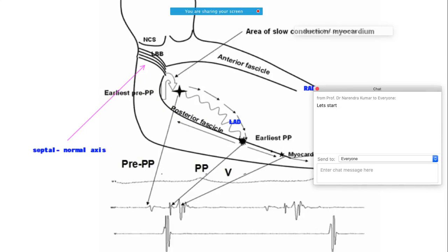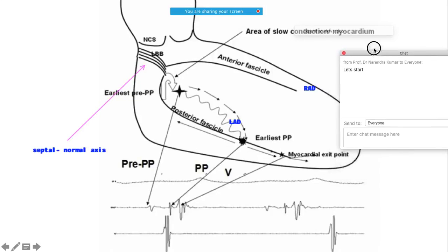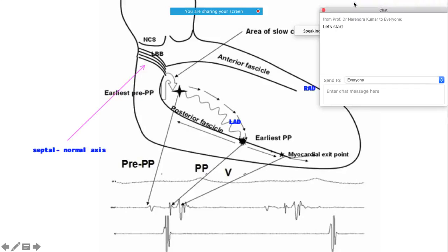If you come across an ECG, first thing we might think, okay, this is a fascicular VT. What are the other things which we may be able to see? So VT, you know the characteristic things. Most commonly, it is wider. But as I said, fascicular VTs tend to be a little bit narrower. So VT characteristic things are going to be there definitely, okay? The axis may be supporting, you already know, the VA dissociation may be there. But what is the other differential diagnosis which you all will be able to think? No one is writing anything.